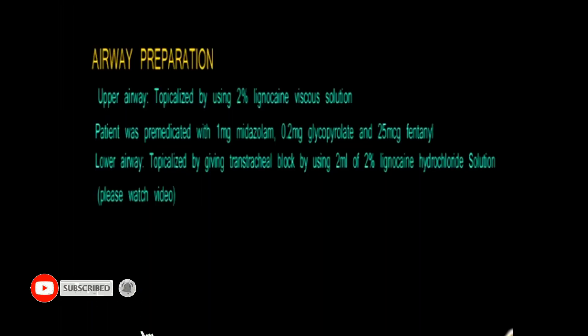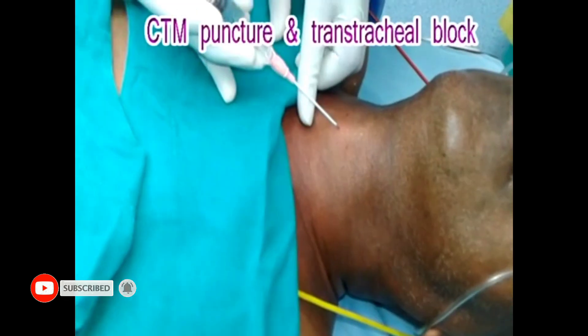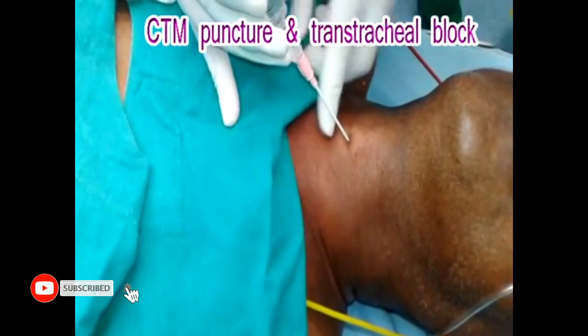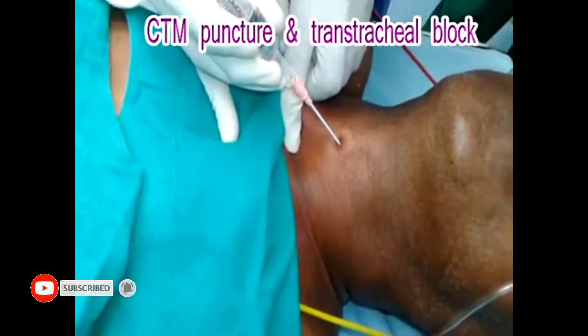Coming to the preparation of the airway, the upper airway is prepared by using 2% lignocaine viscous gargle, and the lower airway is prepared by giving nebulization of 1% lignocaine solution. In addition to the above preparation, a transtracheal block should be given for effective anesthetization of the airway.